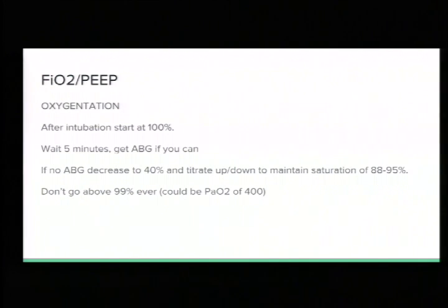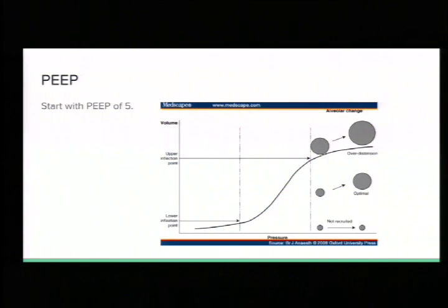Question is, should they have been intubated if they're able to maintain a sat of 98% on 30% FiO2? And some vents, they'll be kind of dual. Ours is separate. Your FiO2 and your PEEP are two separate dials or buttons. And there is, on your handout, the scale for, if you look at your injured patients, of your FiO2 and PEEP that we'll get to in a minute. But kind of find that, and that teaches you how to go up on your PEEP and your FiO2. So in injured patients, these patients can tolerate PEEP.